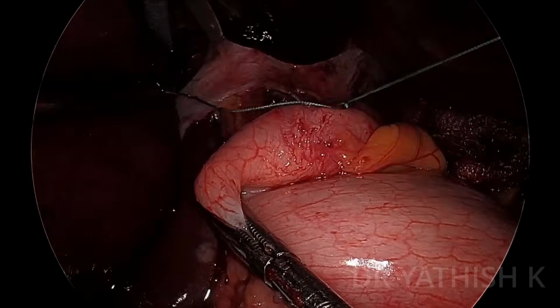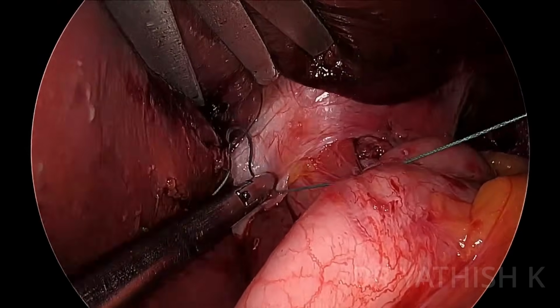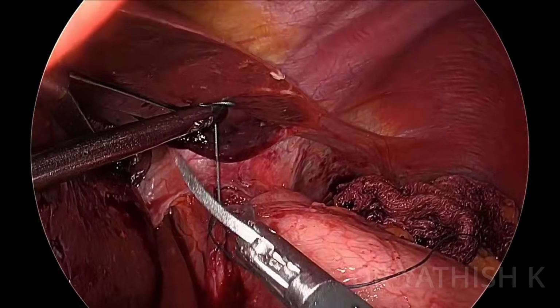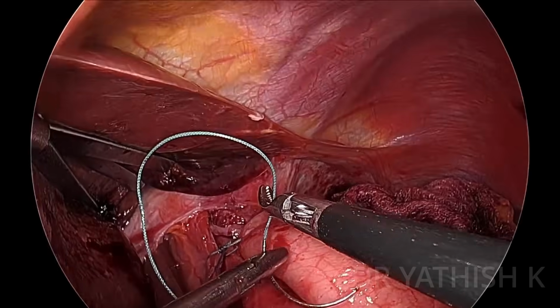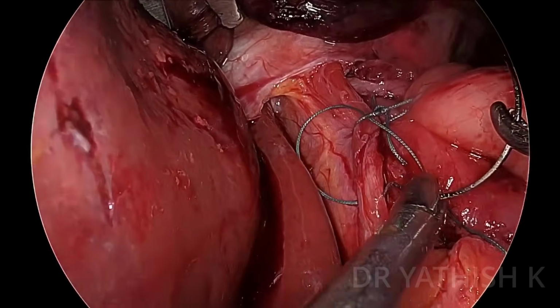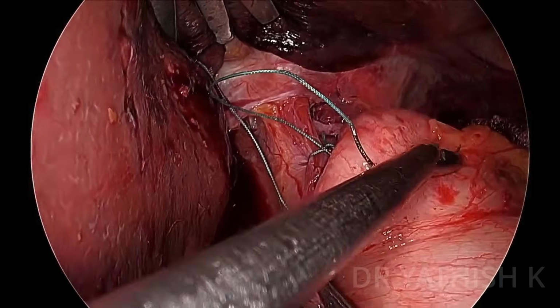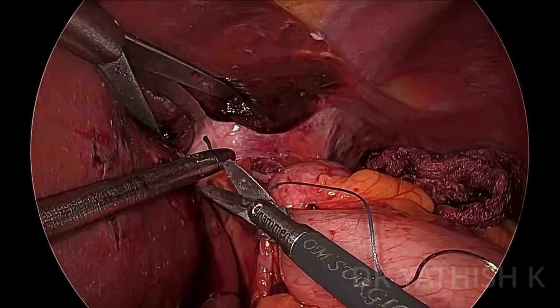Now I'll tell you why we have taken the bites on the right side and the bites on the left side, instead of the standard wrap creation by taking it just on the right crus. The reason is, the bites on the left side will keep your musculature away and prevent postoperative muscular band formation. So there's a reason we have taken both the anchoring bites on either side: to keep the sphincter away and prevent a band from forming at a later time, which would lead to a failed operation.